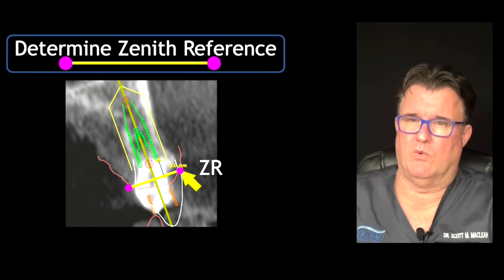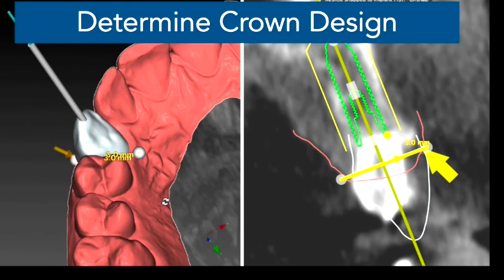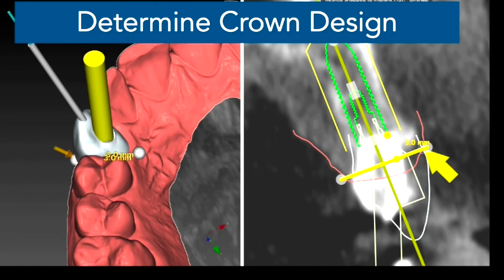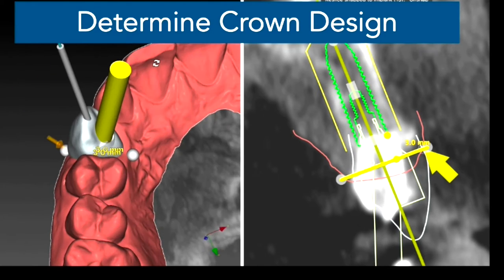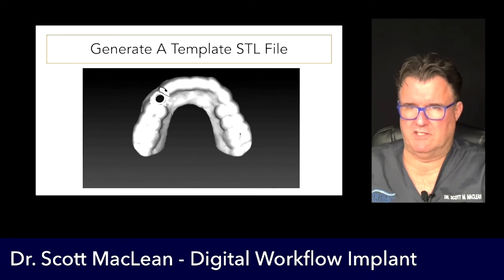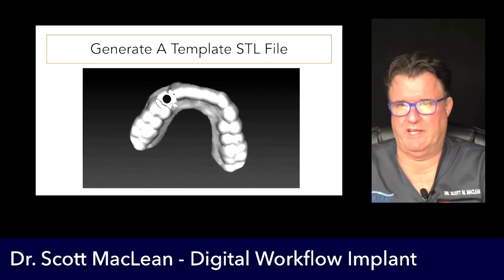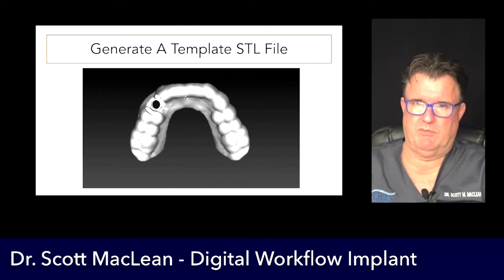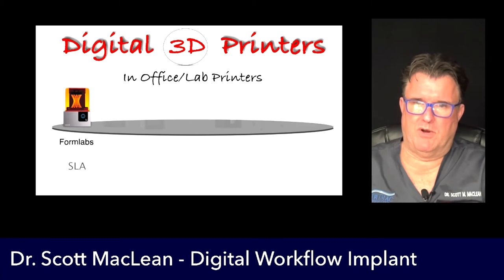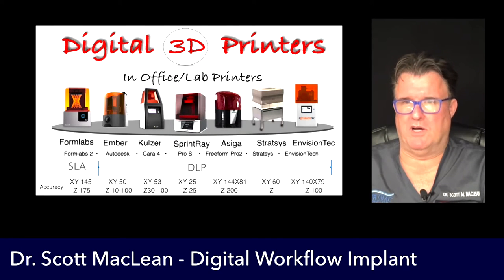The yellow line is called the zenith reference. If you want to read more, I wrote an article about this in Compendium. So if we put the implant at 3 millimeters, we put the implant platform depth to that distance. This allows us to make a template — once we know where the implant needs to go, we check it in two different planes. This determines our crown design as well, because now we have enough space. We angle the implant and fabricate this software-driven outcome. We generate a template STL file, take it to the SprintRay printer, and print it.